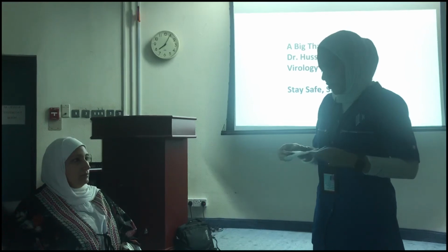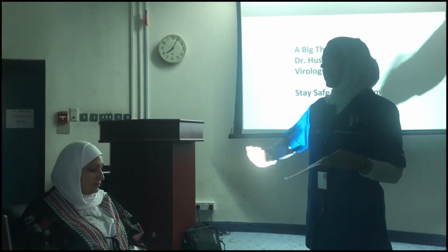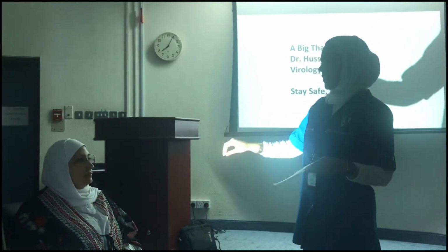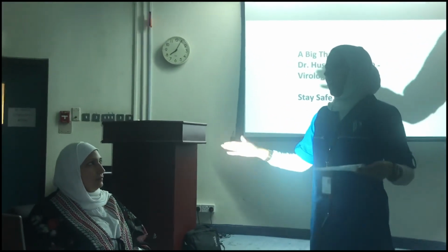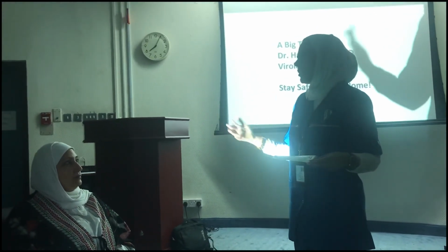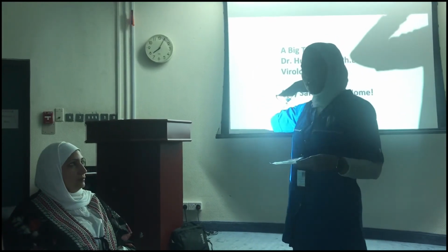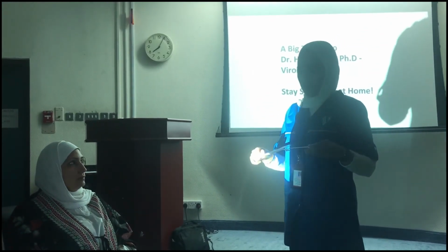You put the patient, usually the patient may be in the hospital laying flat on the bed. If they are comfortable laying flat, you take the sample while they are supine. And if they cannot lay flat, they have respiratory distress or anything, you put them in Fowler position, and the head has to be supported.